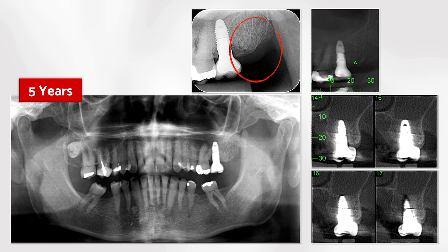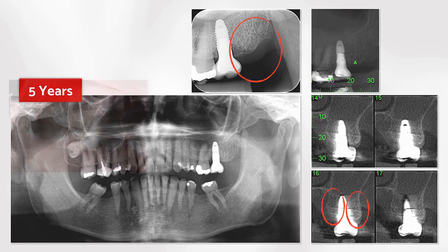Take a look at the bone remodel at the tuberosity area. And sometimes we can take bone 2 or 3 times from the same donor area if we need it. Here the thickness of the palatal wall and the thickness of the buccal wall.